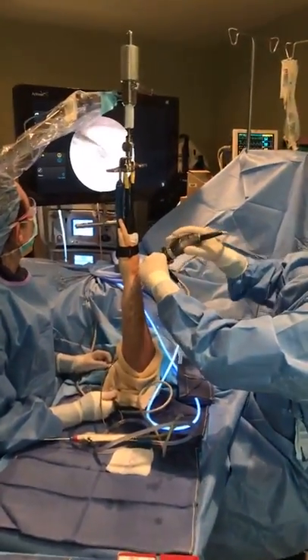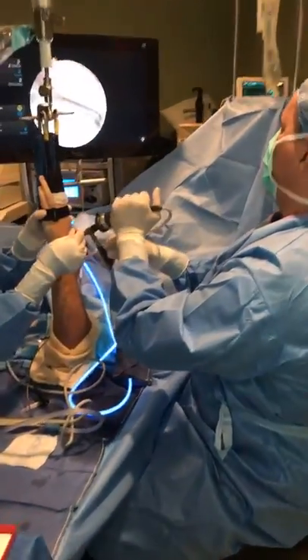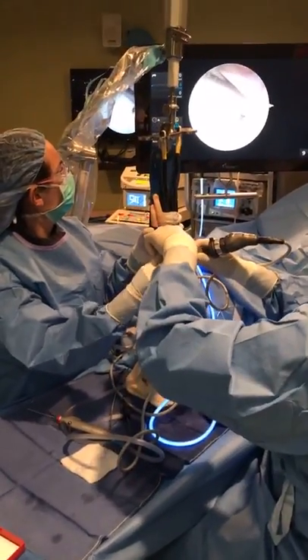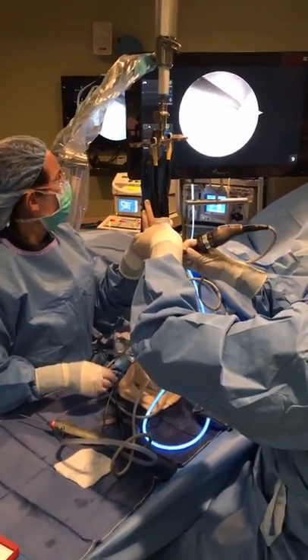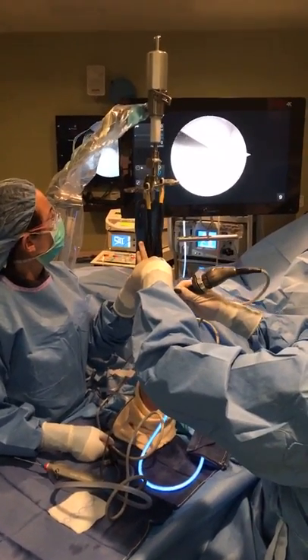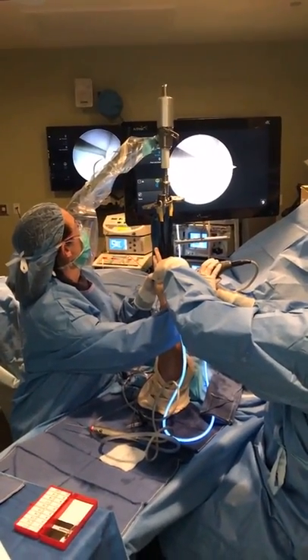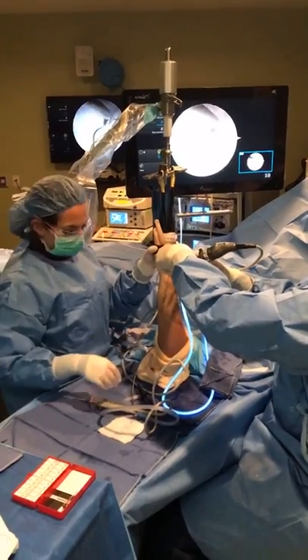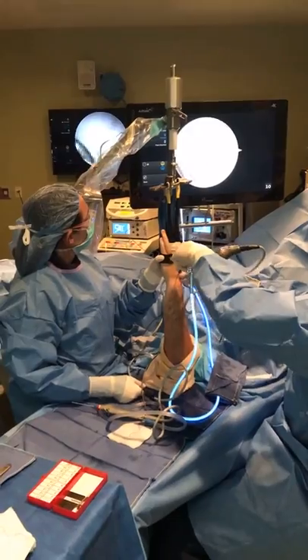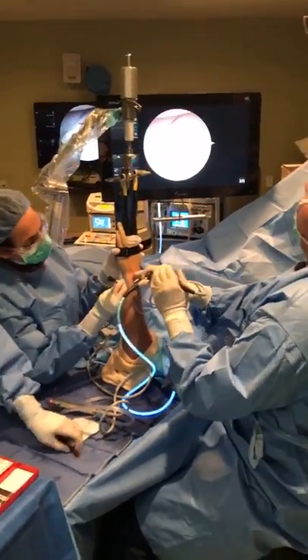So this is a lunate bone. Hold that key. Now I'm a little concerned about the scapholunate, remember? I am a little bit worried about this. Okay, so this would be a grade 2, because I can't rotate it, so take a picture. This probe gives me an idea of what the status of the ligaments are. The most important part of the scapholunate ligament is up here, the dorsal part. And then we follow the scaphoid bone.